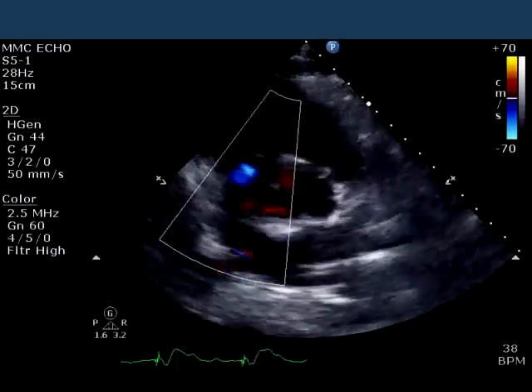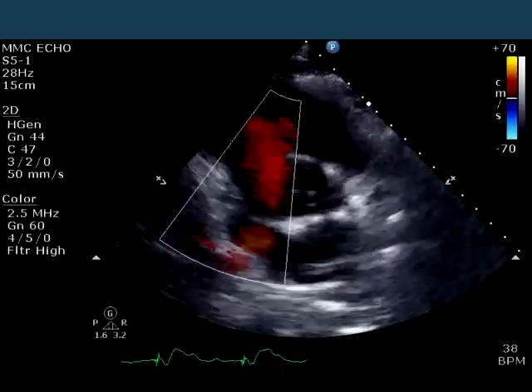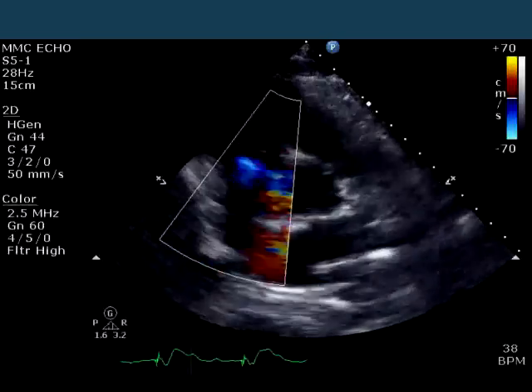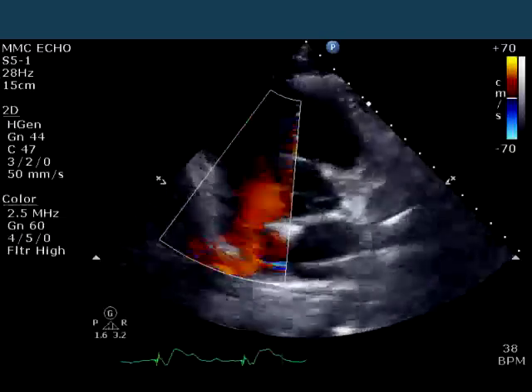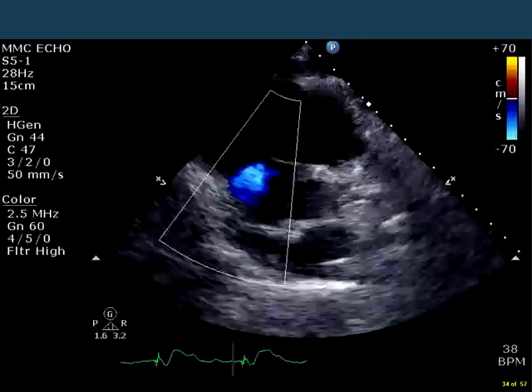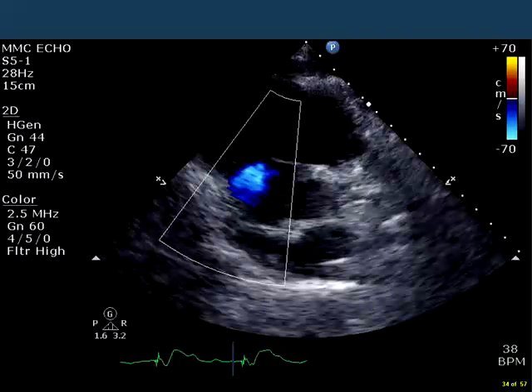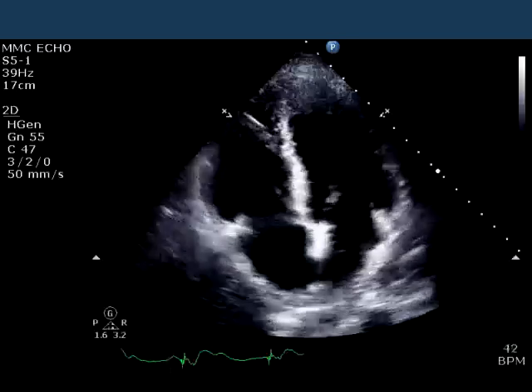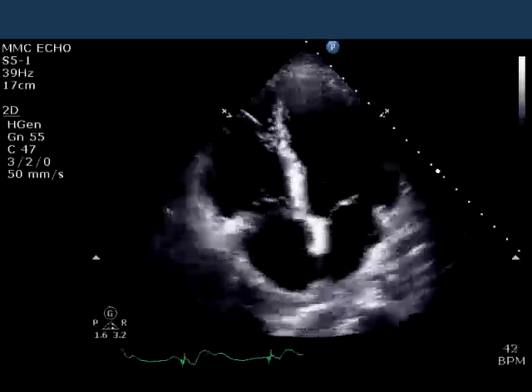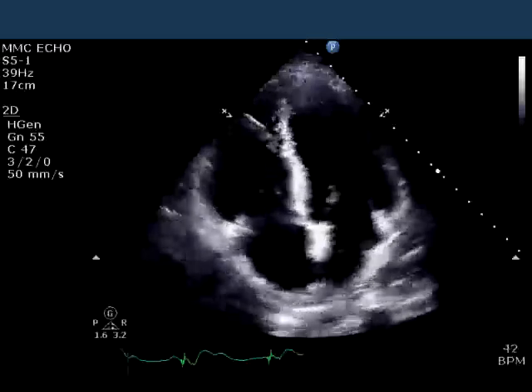In the next slide, you can see a parasternal short axis window through the tricuspid valve demonstrating the tricuspid regurgitation jet. If I freeze the frame in diastole — with the cursor on the electrocardiogram confirming diastole — you can see a non-turbulent jet going away from the tricuspid valve into the right atrium, demonstrating diastolic tricuspid regurgitation. So here's a clue as to what's going on.